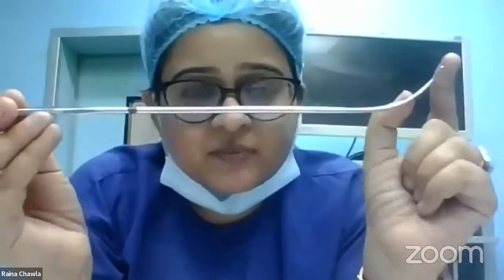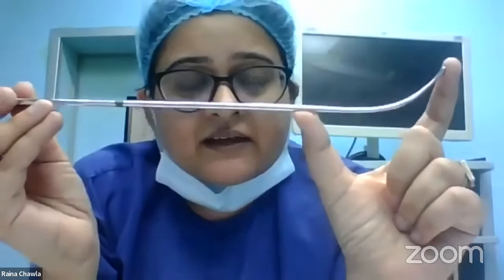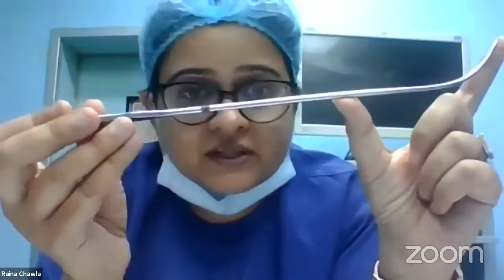Okay, so any endometrial biopsy you're doing or a dilatation and curettage, you want to know the length of the uterus so that inadvertently you don't perforate the uterus. Because say you measure the length of the uterus is 8 centimeters, and then during the procedure, you find that your instruments are going beyond 8 centimeters. So you will now suspect a uterine perforation. So that's why it's important to have an idea of the length of the uterus beforehand only. So this is a uterine sound.